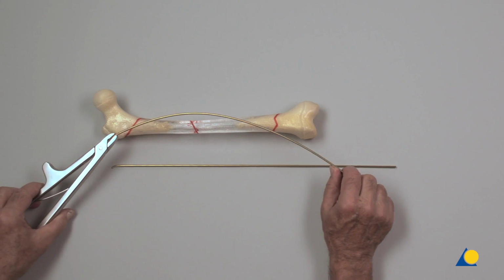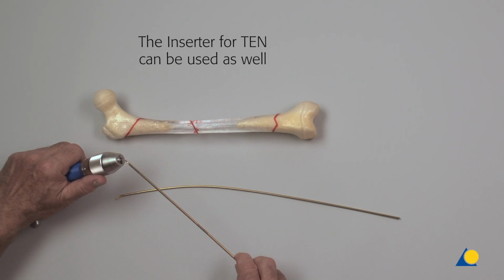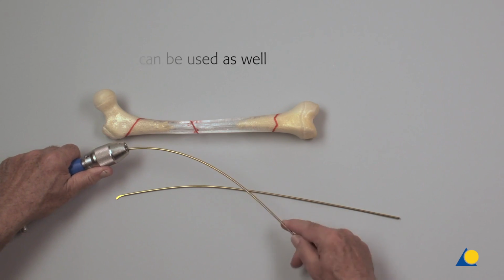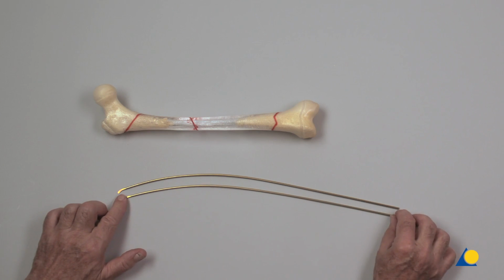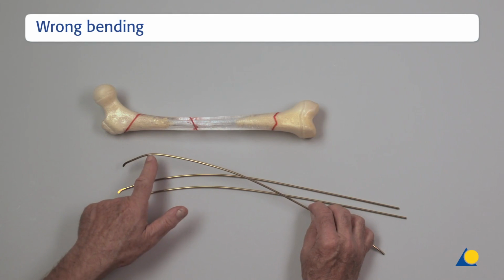To achieve a good 3-point contact of the elastic nail in the femur, it is recommended to pre-bend the nail to 3 times the diameter of the medullary canal over the length of the bone. Note that both nails must be contoured in the same way, and the vertex of the arch should be located at the level of the fracture zone. Avoid creating a sharp bend of the nail, as this may reduce the effectiveness of the nail.